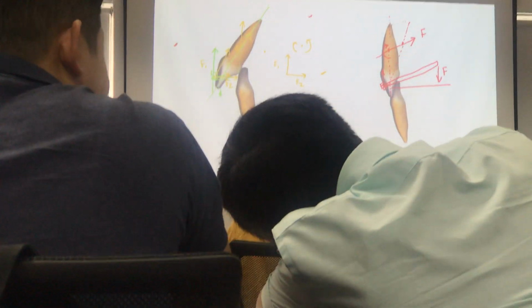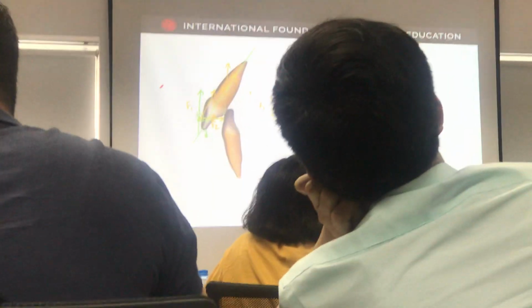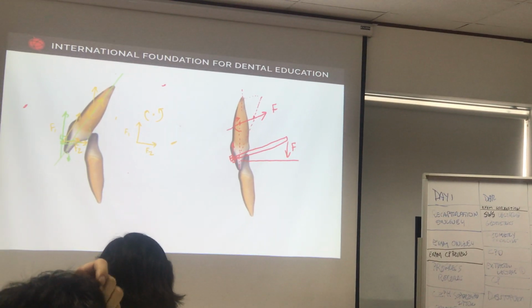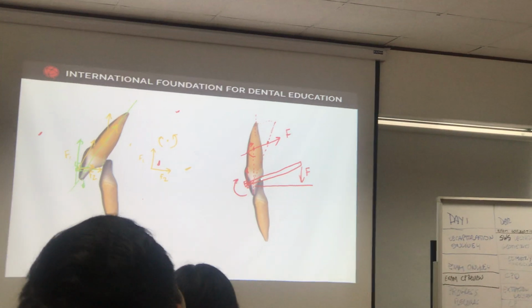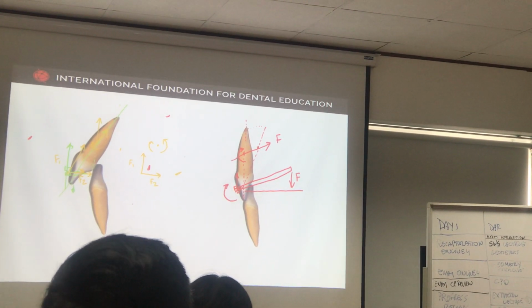We'll bend them on the week. We'll bend them together. Okay. I'll show you the plus and the minus of this. But the idea is because you need this big moment, you cannot do it with playing with forces. You have to add the moment. So normally the size of the wires is 19 by 25, whatever you want, doesn't matter. 19 by 25.